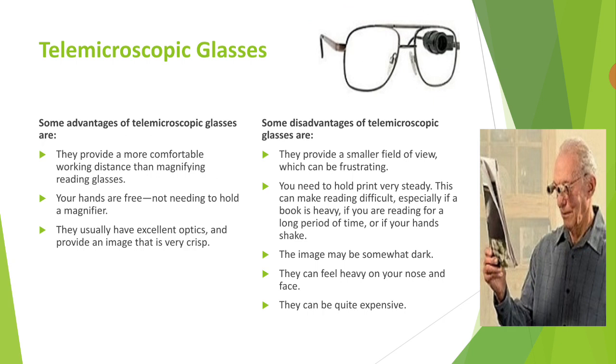When the patient needs to hold print very steady, it can make reading difficult, especially if a book is heavy or they are reading for a long period of time and their hand shakes. The image may also be somewhat dark, and they can feel heavy on your nose and face, and they can be quite expensive. So those are the disadvantages of telemicroscopic glasses.